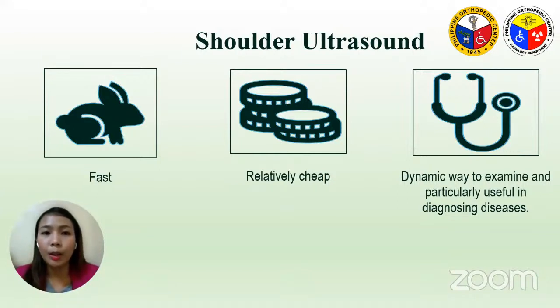It is important to keep in mind that even though ultrasound can be helpful for many shoulder problems, there are times when other imaging methods, like magnetic resonance imaging, or the MRI, may be better. Your doctor will decide which imaging method is best for you based on your individual symptoms and medical history.